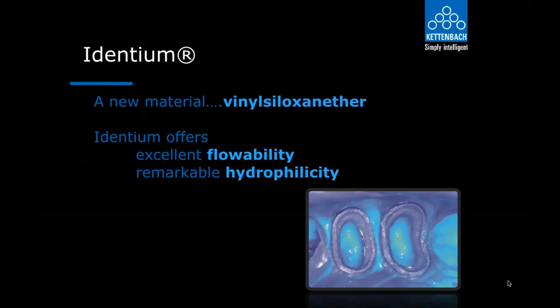If I use a fast set, like for a single unit, which I very seldom do, I prefer regular set. That gives me enough time. I know the materials are coming together, and I'm just a regular set person.